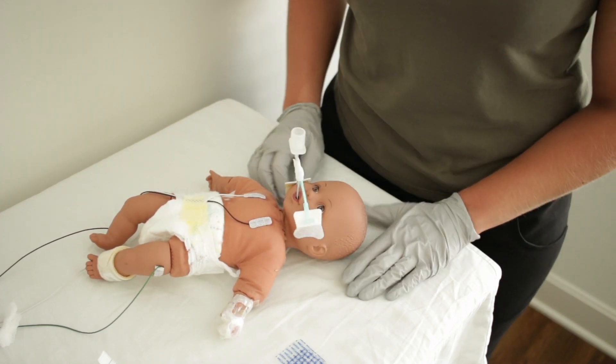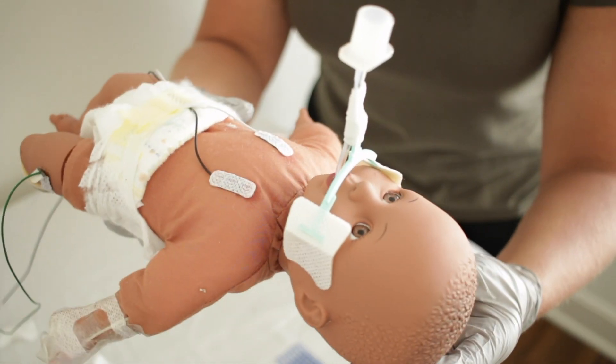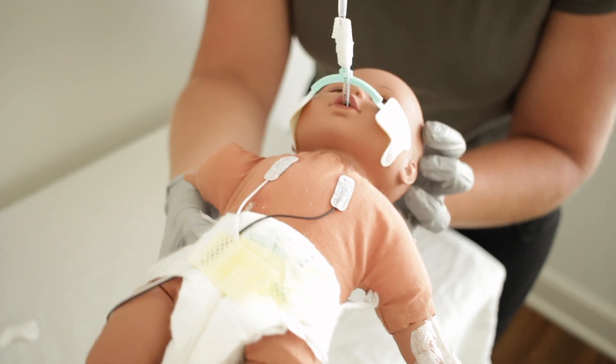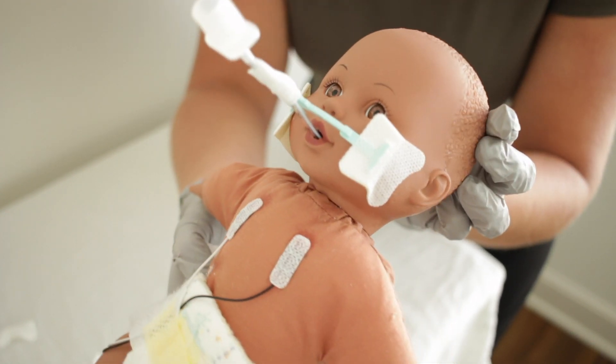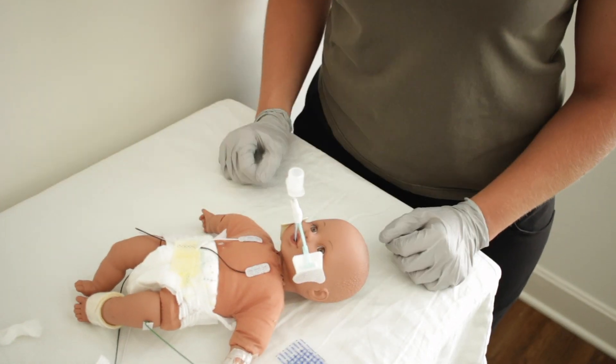Typically, this is done in a candy cane fashion of the ET tube. To remove the neobar, you have several options. The first is in a controlled setting where you can use adhesive remover on the tabs and remove the neobar and attached ET tube. The second option is in an emergency situation — you can use blunt scissors to cut the neobar at the junction of the tab and the neobar, pull out the ET tube and neobar immediately, and then use adhesive remover on the tabs left behind at a later time.